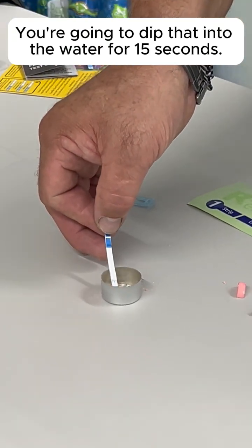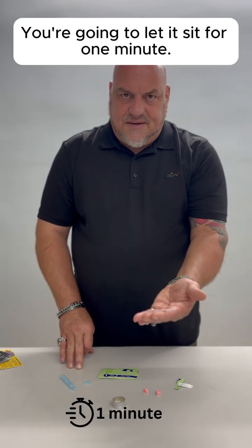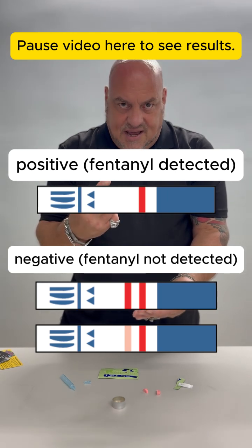You're going to dip that into the water for 15 seconds. You're going to bring it out and let it sit for one minute. One line is positive for fentanyl. Two lines is negative.